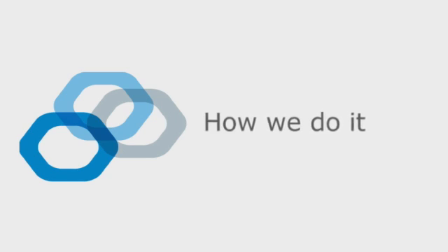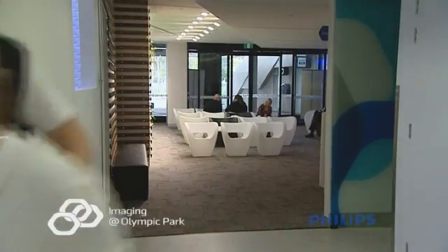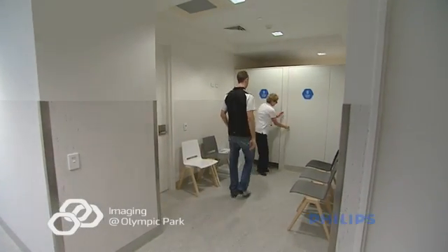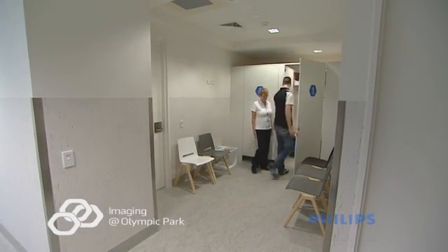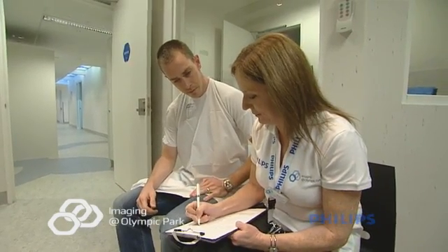Our radiographer or nurse will call you through to the CT section of the department, where you may be asked to change into a gown but leaving your undergarments on. Our nurse will ask some questions regarding your medical history and possible allergies.